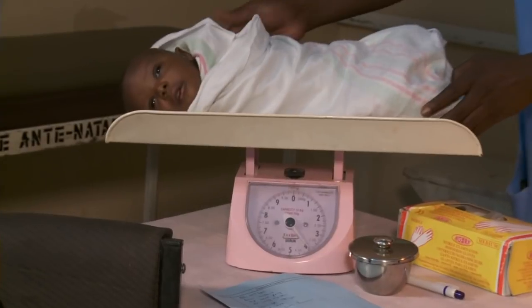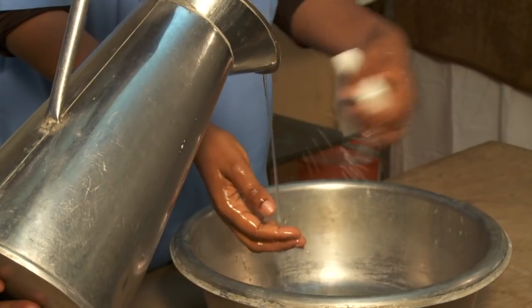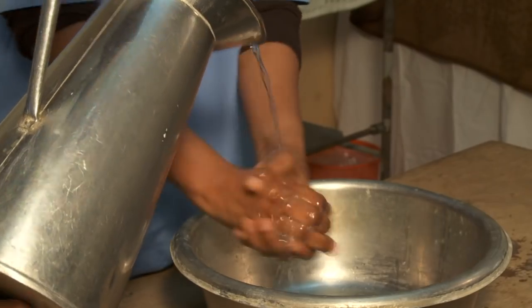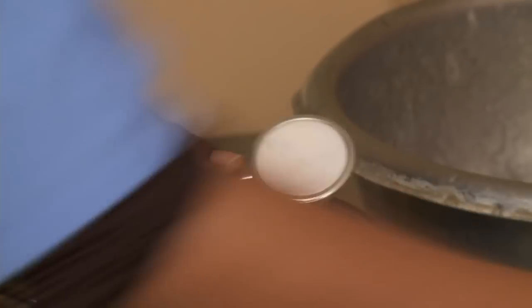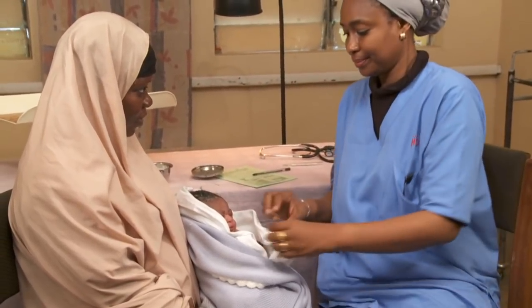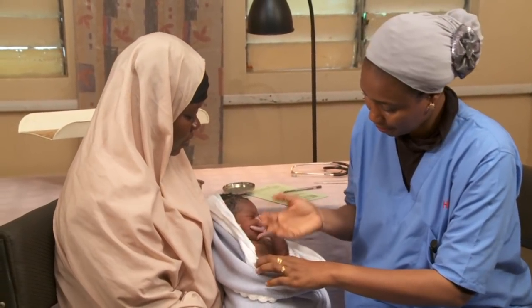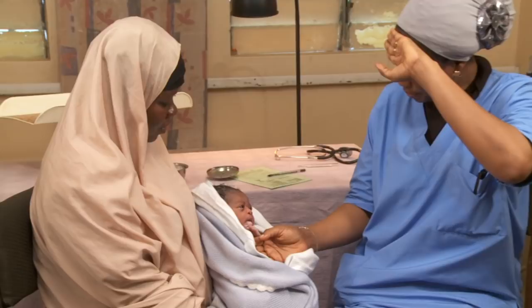First, wash your hands, then clean the thermometer and stethoscope with antiseptic. Here's how to determine the baby's temperature. If you don't have a thermometer, compare the temperature of the baby's trunk with your own body temperature using the back of your hands.